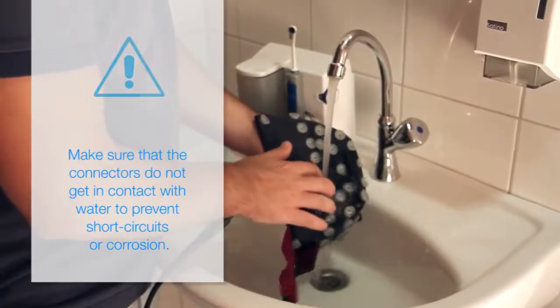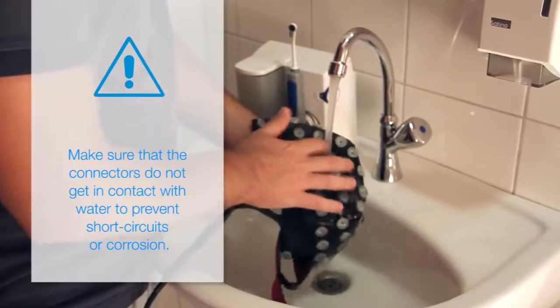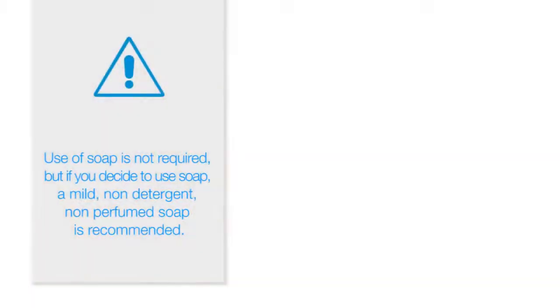To wash the cap, hold it inside out with one hand while rinsing the gel out of each electrode cup with a firm spray of water. Use of soap is not required, but if you decide to use soap, a mild, non-detergent, non-perfumed soap is recommended.